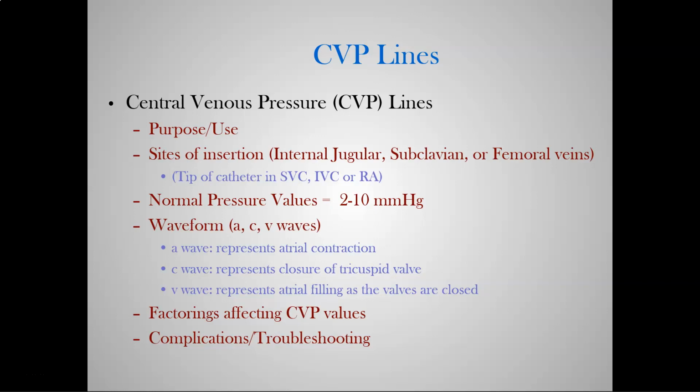Okay, there are critical indicators with this, and there are critical indications of what can happen to a patient if they stay in a persistent state of decreased CVP, especially in the ICU when you have critical patients. We measure maybe an arterial pressure. We're trying to keep that MAP above 65. Don't forget MAP, mean arterial pressure. You have to have a certain amount of pressure at all times to perfuse the brain, the heart.